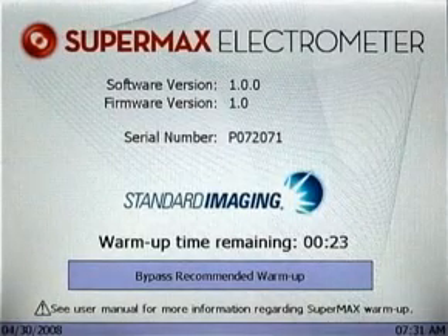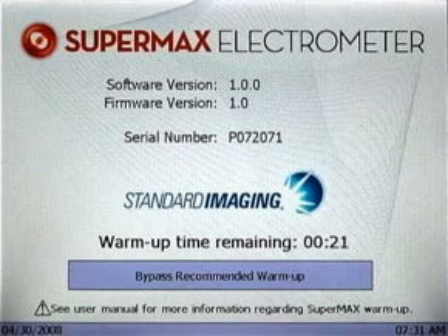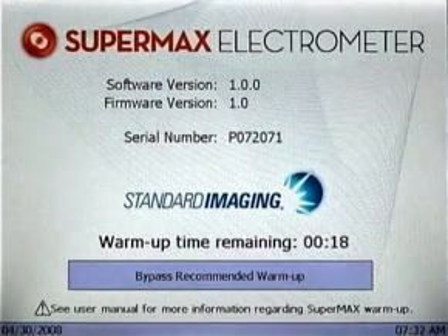This video demonstrates the basic functionality of the SuperMax Electrometer, including selecting the range of operation, adjusting the bias level, and performing a charge collection.